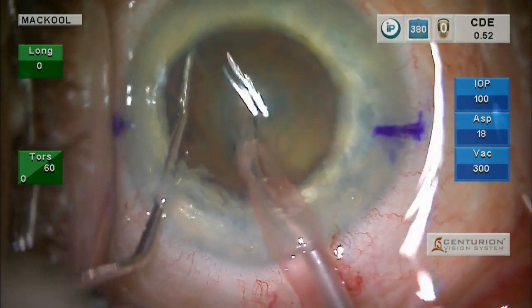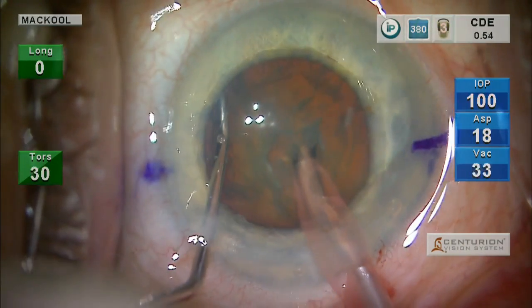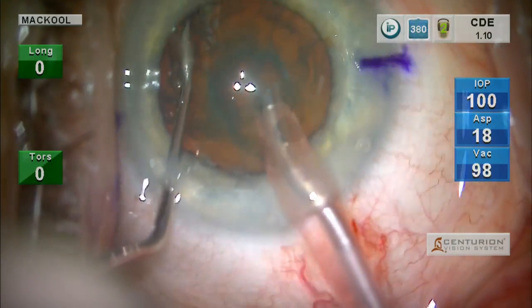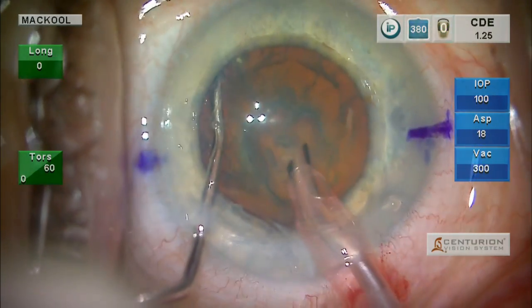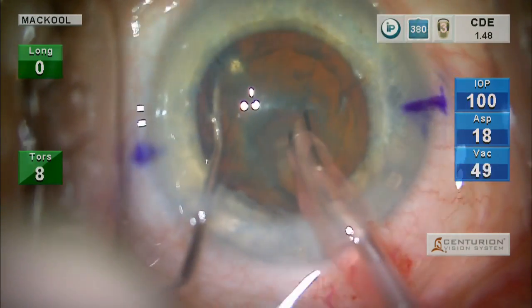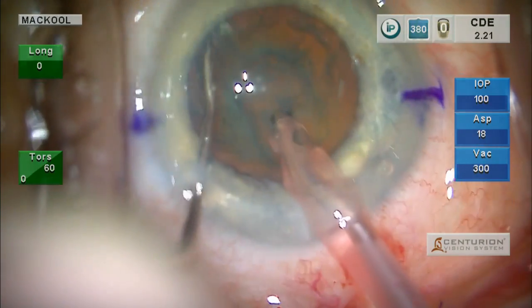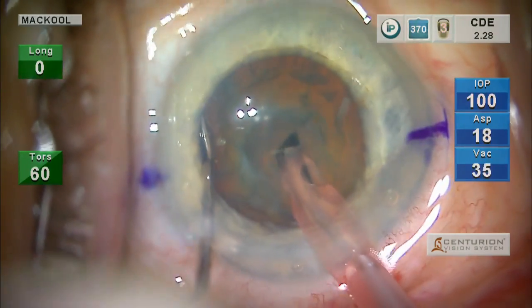One is I might attract it. Probably wouldn't. But 2, I'll remove the Viscoat that's there. And then my invisible pupil dilator, chondroitin sulfate product, is gone. And then my pupil gets smaller.